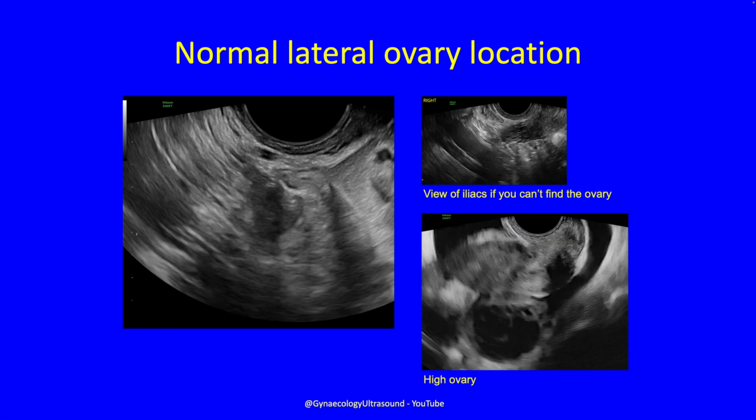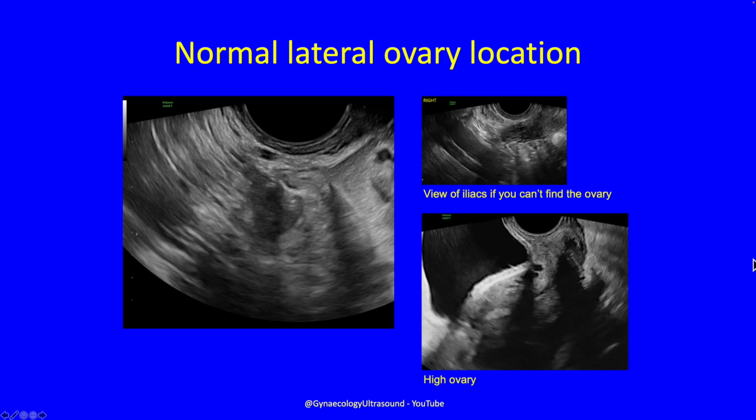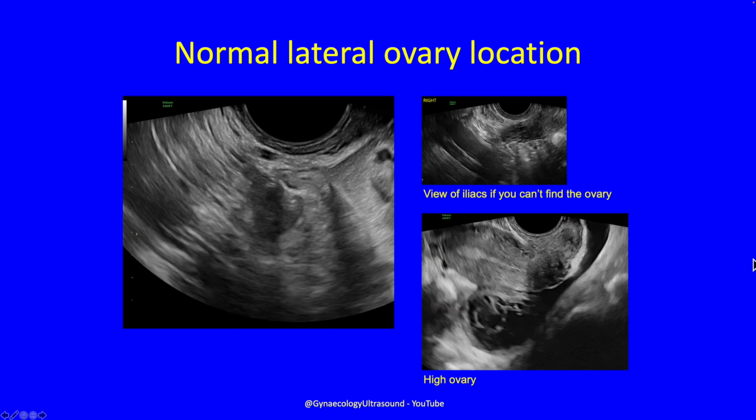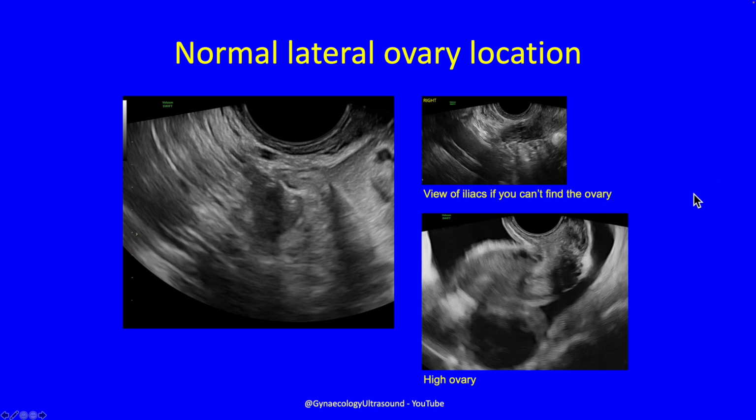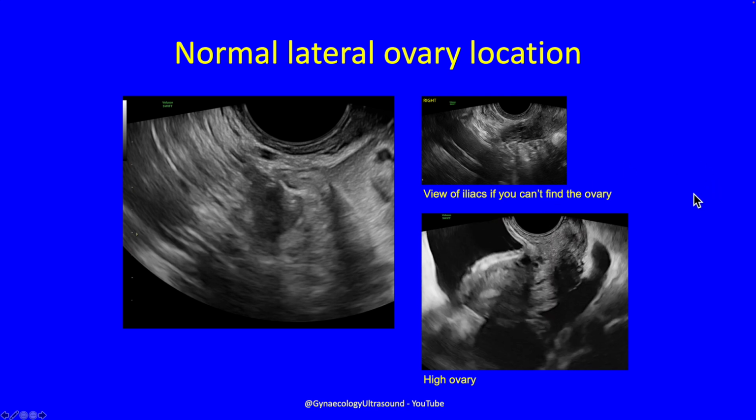And sometimes, of course, the ovary is very high. It's at the level of the uterine fundus. This is me doing a sliding sign where I'm very gently pressing the probe in and out of the vagina. It's just very gentle movement. Patients won't even notice you doing it.